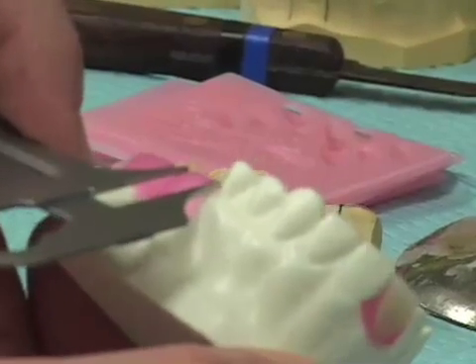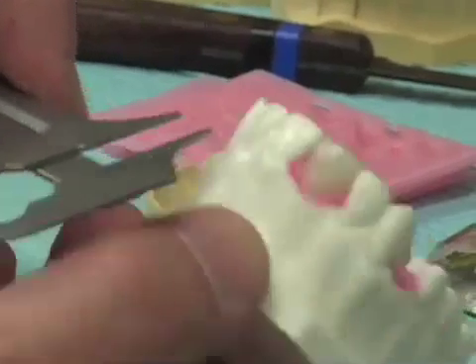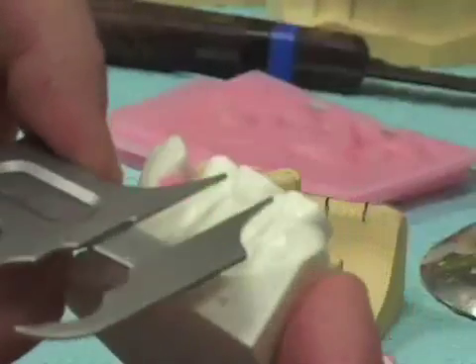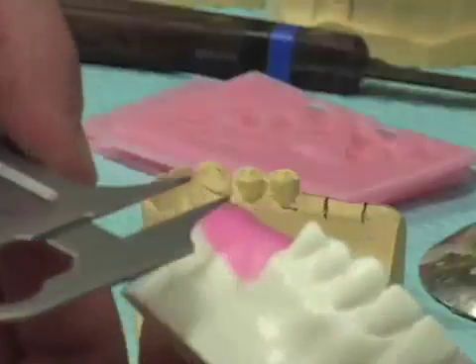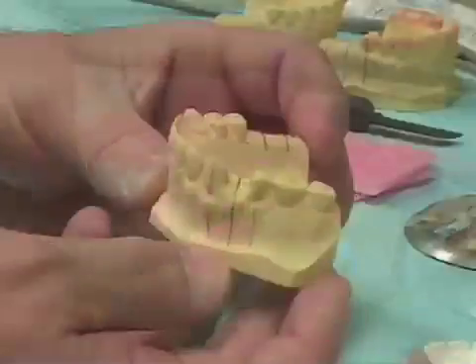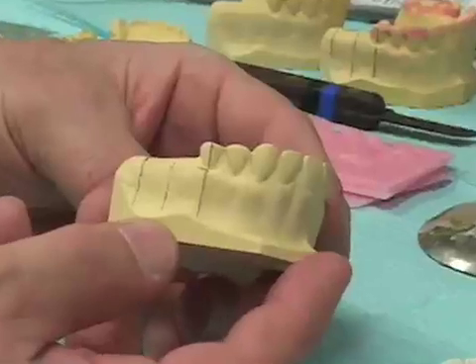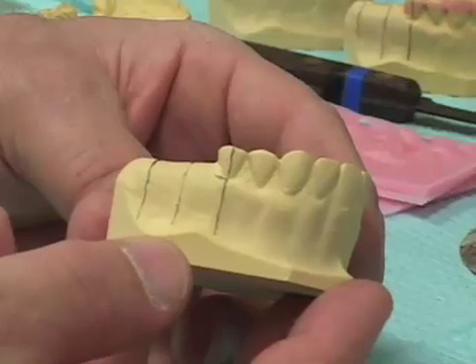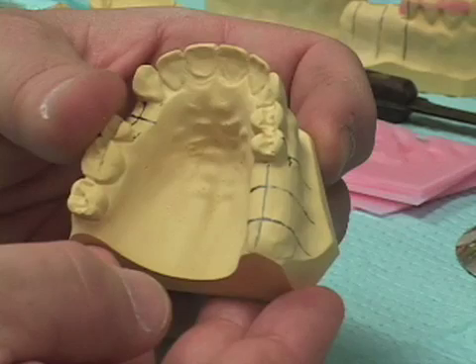We can also go to the patient and measure the distance from the center of the two teeth on the opposite side and transfer that from the center of our first implant to the center of our second implant. In the case where we're working on the patient's left side, we have the proposed location for the two implants on the patient's left side.